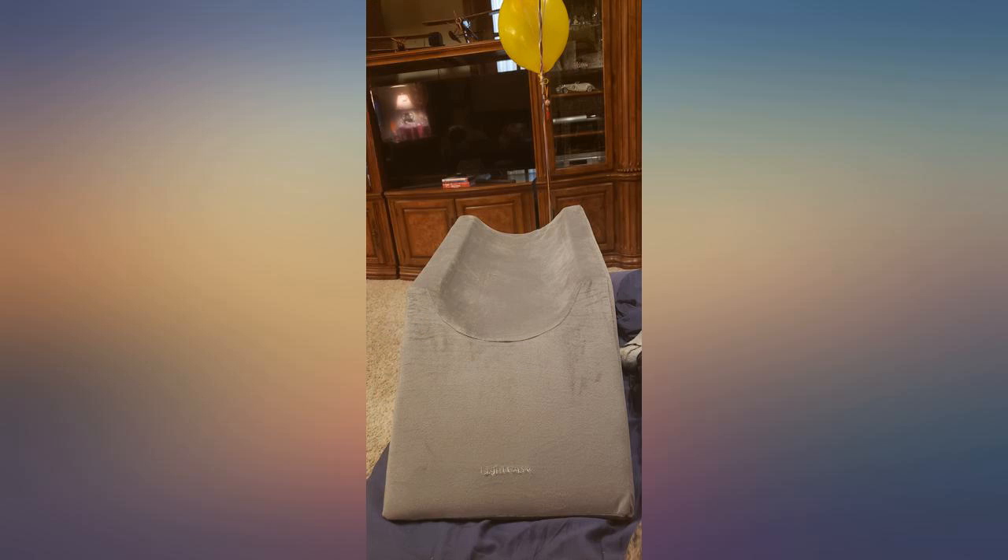I am currently able to use this cushion while sitting in my recliner and can honestly say I am feeling comfortable for the first time since the surgery.